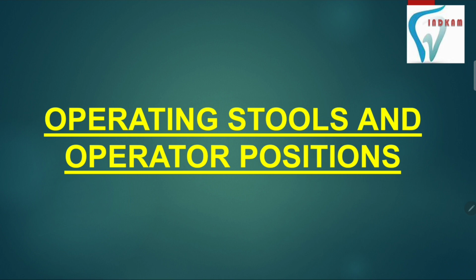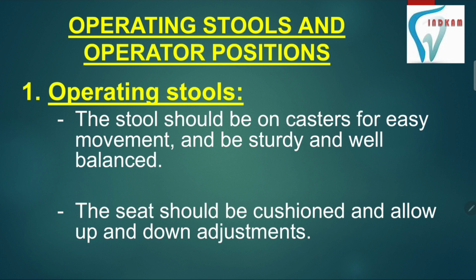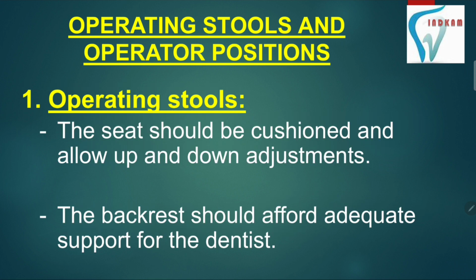Now talking about operating stool and operator's position. First we will talk about operating stool. Nowadays there are several designs of operating stools available. The stool should be on casters for easy movement and be sturdy and well balanced, and the seat should be cushioned and allow up and down adjustments as well, and the backrest should afford adequate support for the dentist.